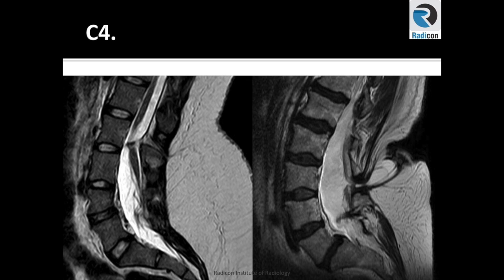There is increased AP diameter of the thecal sac and hence dural ectasia is present. There are some suggestions that if the AP diameter of the thecal sac at S1 level is greater than that of the thecal sac at L4, then it is dural ectasia. This is true, but not always applicable as in this case.